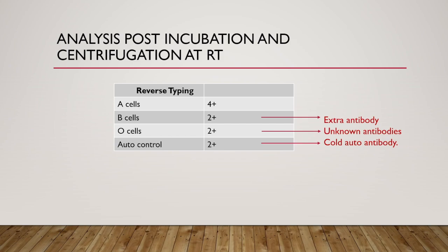We can see that in A cell there is a 4 plus strong agglutination reaction. In B cell also there is a 2 plus reaction, which should be possibly due to an extra antibody. In O cell also we are getting a 2 plus reaction, pointing to an unknown cold antibody. In autocontrol also we are having a 2 plus reaction, which should be possibly due to a cold autoantibody. Hence, to resolve this, we will be proceeding to further testing at 37 degrees Celsius.